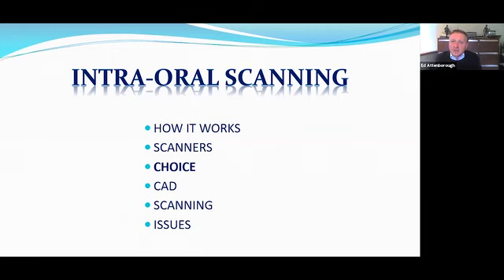And this will tend to narrow down your choices in whether you have an integrated system or a pick and mix system where you put together third-party software and handpiece. Is your practice on one level, or is it on multiple levels? So do you want a cart, or do you want a laptop version? I would definitely say open scanning, STL file output is very important, as is color scanning and texture scanning. So these are some of the things that you should be thinking about, as well as interconnectivity.